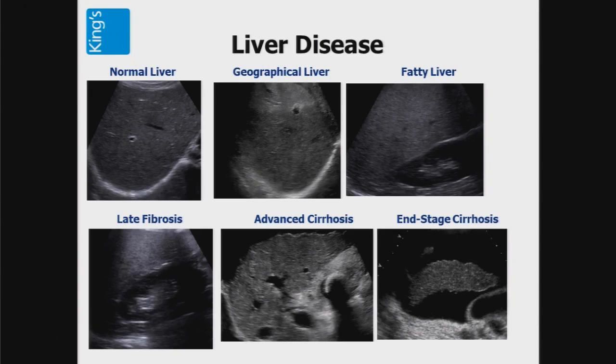Anyway, you've got a normal liver and you've got a cirrhotic liver. It's very easy for you to differentiate between those two.